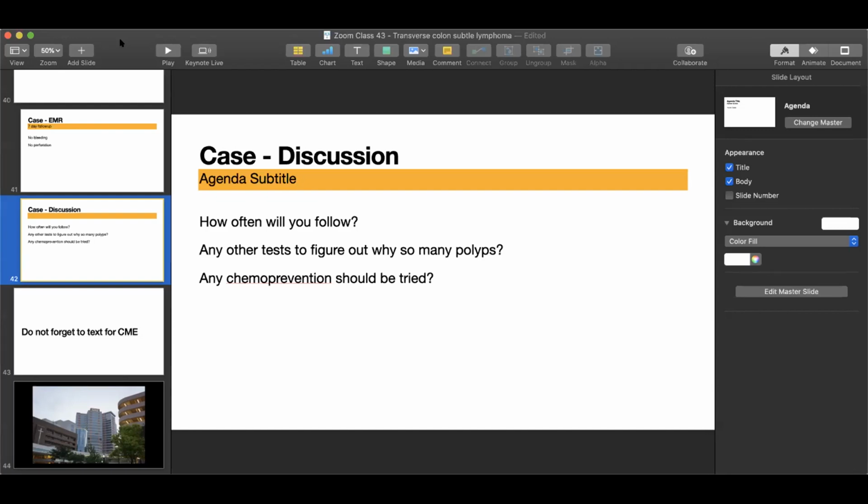Okay, let me ask you this. One of the reasons I was put off by the injection and snare combination is that, although I like the concept, it is harder to push through a pediatric colonoscope. Are the current snares smaller now and easier to use? There is one. I agree, because the bulk has to be bigger than for just a snare, it will compromise the lumen. But I've used it with both pediatric and adult scopes, as well as the therapeutic gastroscope. But the advantages have to be weighed against the issue of suction that you need during the procedure. That's the balance.